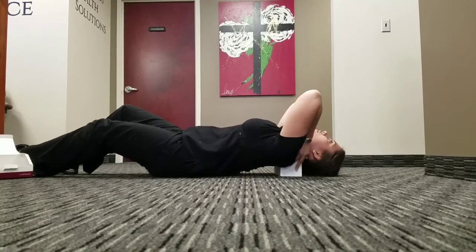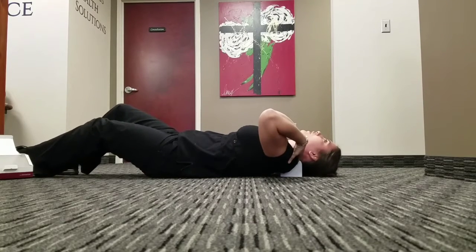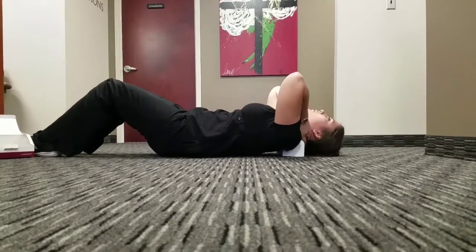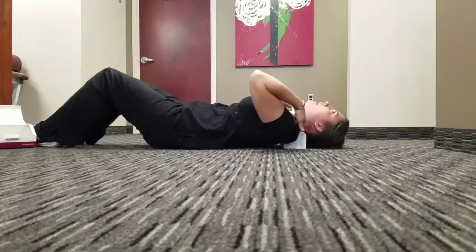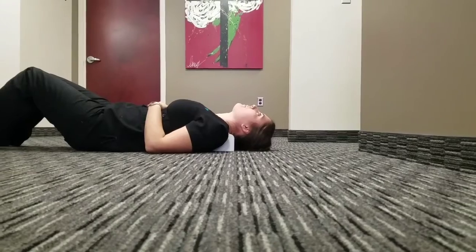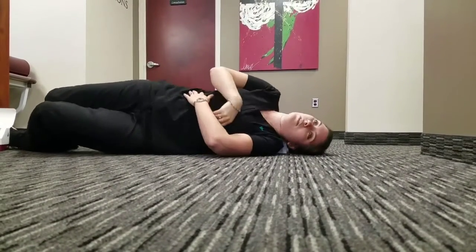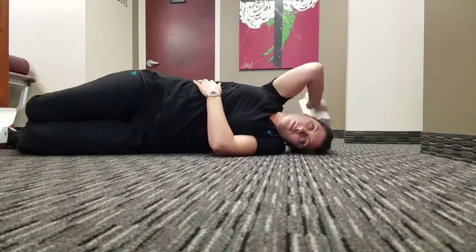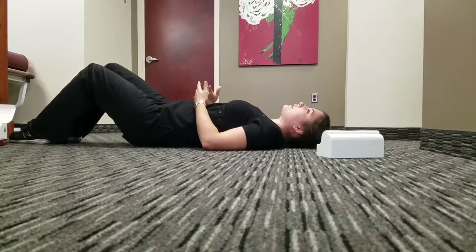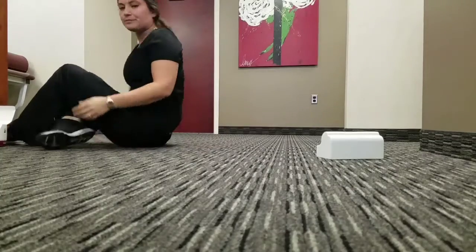So if you're doing the low neck, you're going to have this so far down that it's almost like your shoulders are on the pillow. But you want that little hump that's in the back of your neck, you want that to be draped over the highest part of the pillow. You're going to lay here comfortably for 30 seconds. After the 30 seconds is over, you're going to roll onto your side, move the pillow out, roll back onto your back, lay here for approximately 30 seconds, and then slowly rise, and you're all done.